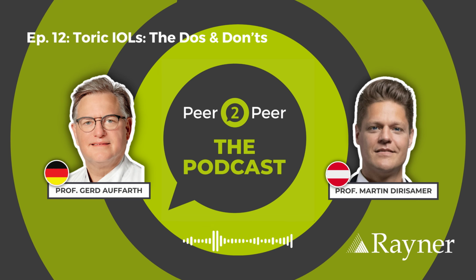I would say, maybe you agree, that with multifocal or trifocal lenses, you may even go below 1 diopter or 3/4 of a diopter to make sure that they don't have astigmatism. With a normal monofocal lens, it may not be that big of an issue if there's a little bit more. So yes, I have experience with that, but I rarely use the customized ones because it's not so often that it's really necessary. I really have to say that.